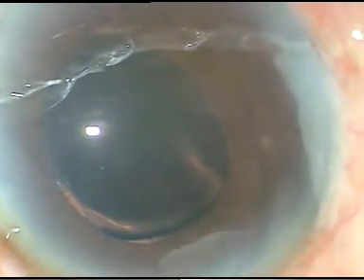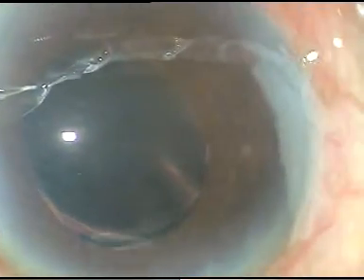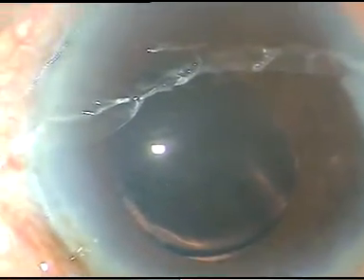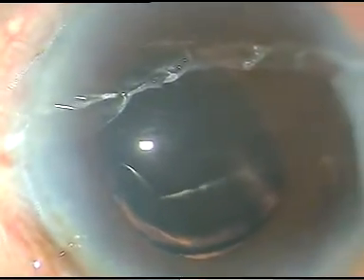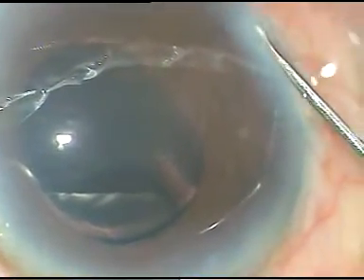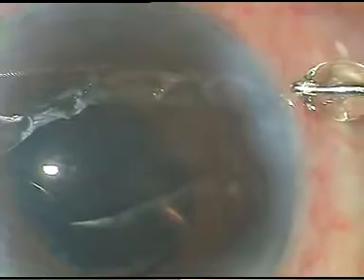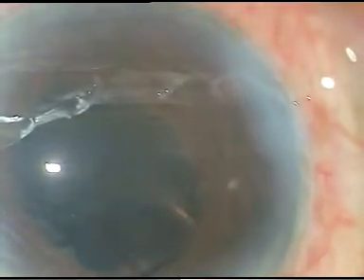Just checking if I need to put any suture, and I see that it is not necessary. Now I hydrate the side ports. This is the side port at 8 o'clock. The other side port is also hydrated, and this is the final wash.